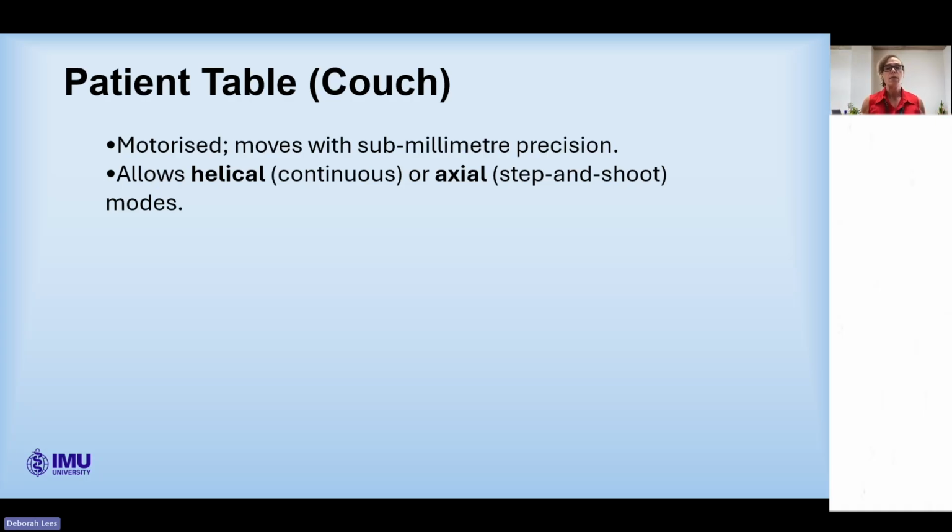But it does mean that we've got limitations as to positioning. So we need to position someone supine, or we can position someone prone. We do very occasionally position someone lateral lying in the lateral decubitus position, but that is very unusual for us to do. It's not really set up for that. But occasionally people do have disabilities or issues where we do have to become a little creative with the positioning. And then we normally support them with pillows and foam, which are specific elements that we use.